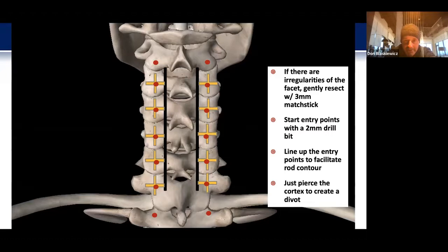I make sure my entry points are lined up so the whole continuum is confluent, and I'll also position my thoracic screws in alignment with the lateral mass screws so I don't have a major offset at the cervicothoracic junction. Then I pierce the cortex with this bit — I won't get deep into the lateral mass and won't start to deviate, since this isn't a backstop drill with a guide. I just pierce the cortex.